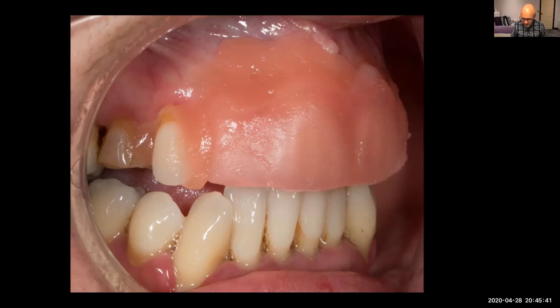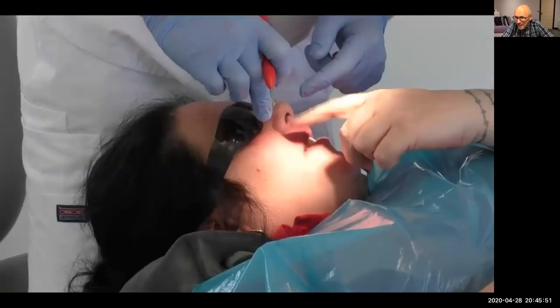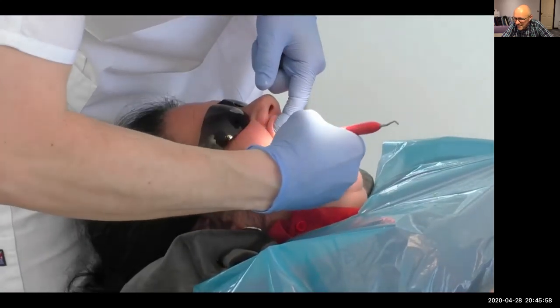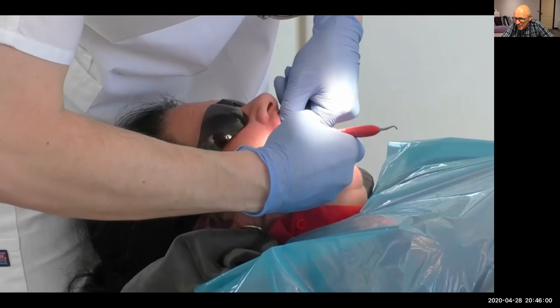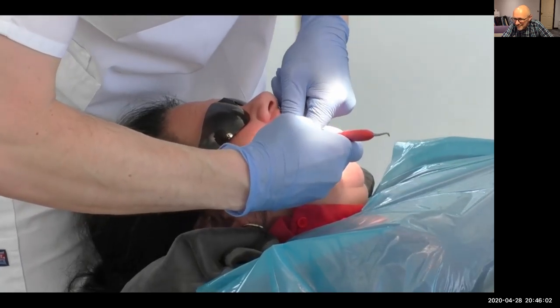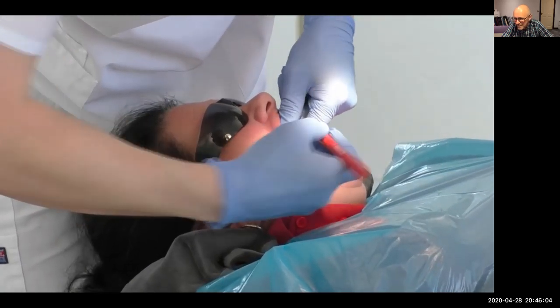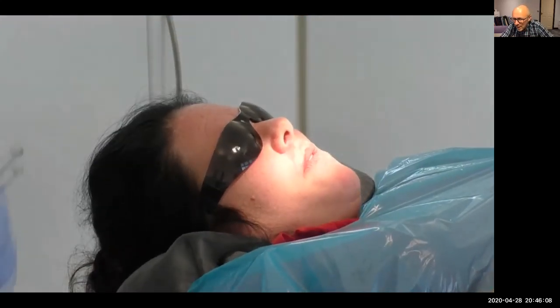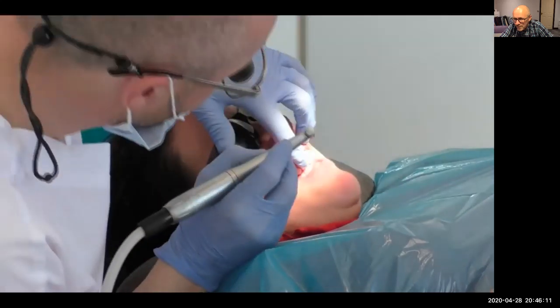But you know what? About 18 months ago, I was doing exactly the same thing for a patient as I was doing for Wendy there, and I forgot to move it in and out. And here is Diane with it stuck in the mouth. I just fitted it and I didn't move it in and out. What an idiot, schoolboy error here. And so it took me an hour and a half to cut it free.